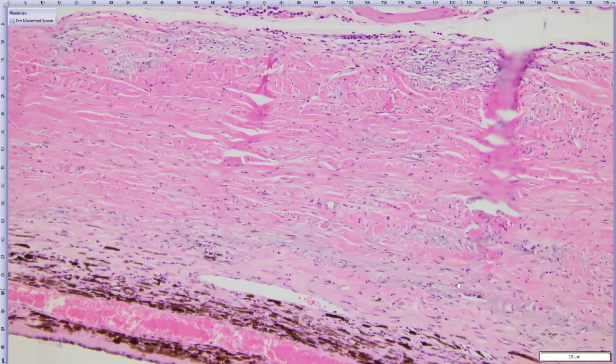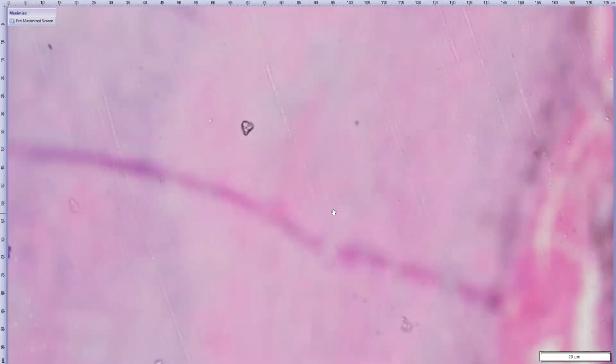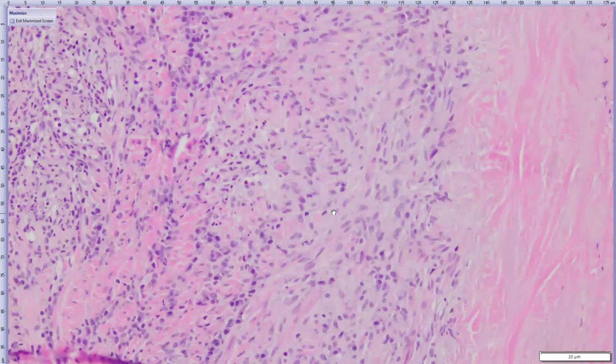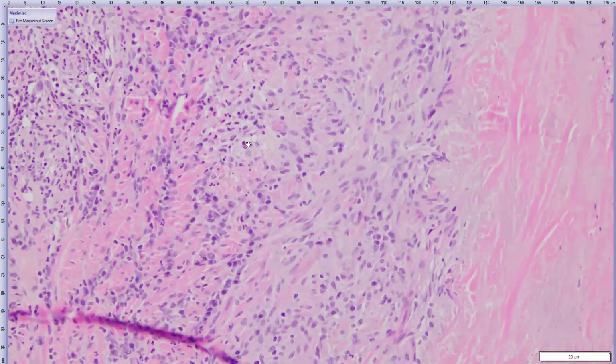And we can kind of make out those areas here and there of this collagen devitalization. And I go all the way back to the posterior segment. Well, one more. We can see maybe there's a little bit of even an expansion of this posterior sclera. As we go closer, we have more inflammation within the sclera that's kind of similar to that nodule. So just a lot of macrophages, all of these guys. Again, kind of some plasma cells, lymphocytes, neutrophils. This one also, maybe there's an eosinophil right there. I found one. Here and there, a few of them.